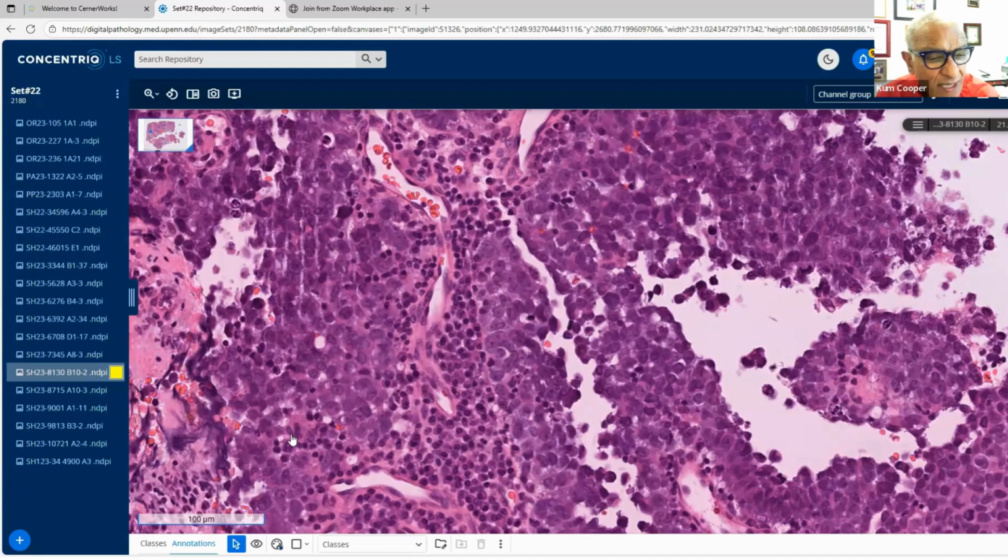So the immunohistochemistry that you perform for SMARCB1 and SMARCA4, which is BRG1, and INI1, as Shaheen has put it in the chat, INI1 deficient. So in that context, when I'm doing INI1, I always do BRG1 as well. So I do both SMARCB1 and SMARCA4. And again, before I give you those results, these are all good differential diagnoses in the context of these small round blue cells that you're giving me.